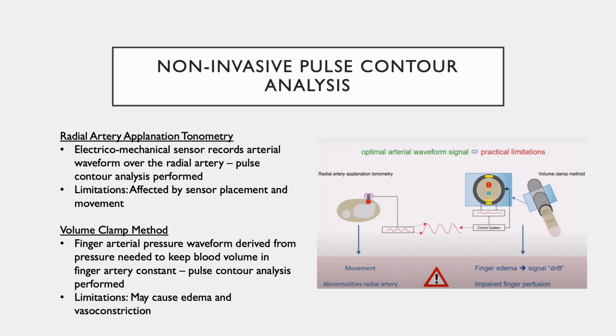So the next few slides will discuss some of the less invasive monitoring modalities. While they may be attractive for this reason, their accuracy in critically ill patients is yet to be established. Most of these devices are being explored in a perioperative, emergency department and inpatient ward setting amongst patients with perhaps slightly higher illness acuity that require closer monitoring. Their robustness and reliability in the ICU context has not been established. Hence, I'll just briefly cover some of these modalities.